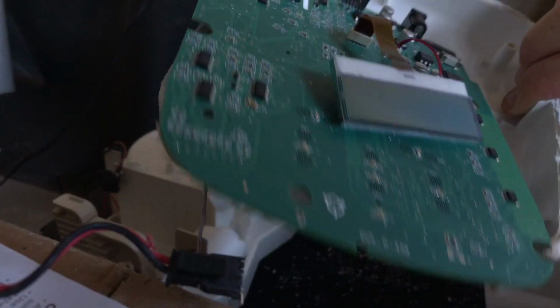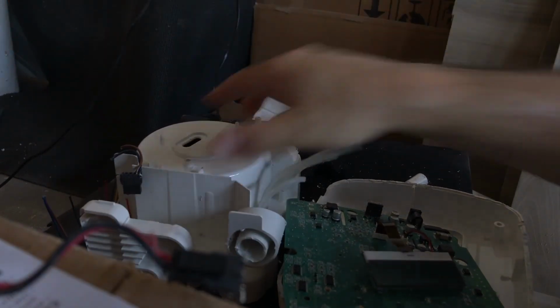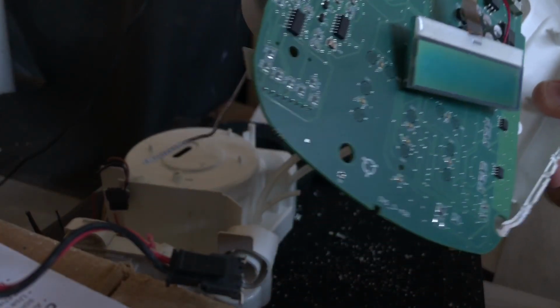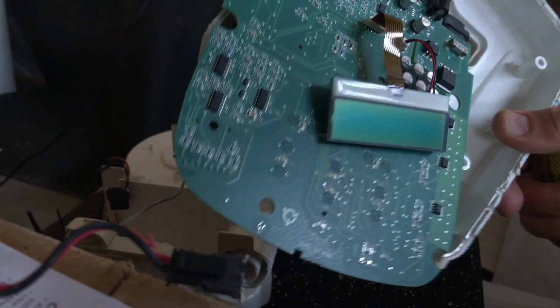Okay. Anyway, so there you have it. The DeVILBISS CPAP machine from about 10 years ago. Now they're much more advanced and better for patients. And this is an old one. I just wanted to show you what's inside the thing. Quite difficult to open without the right tools, but that's it.